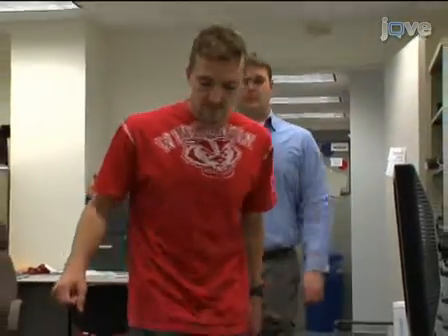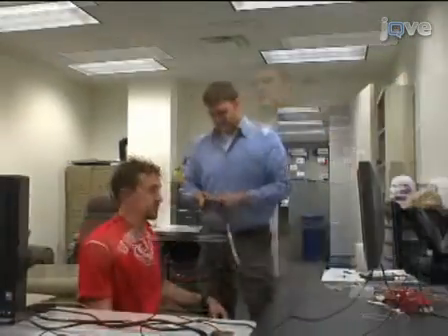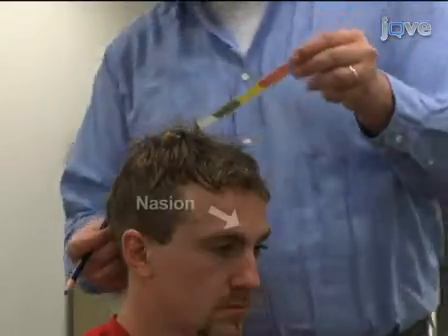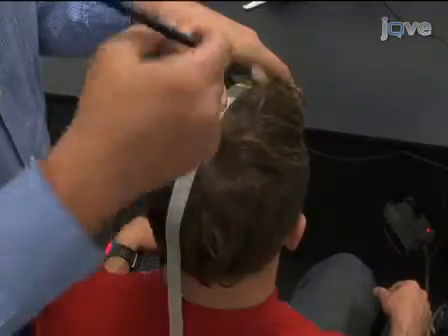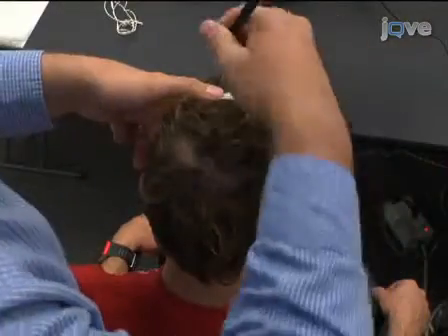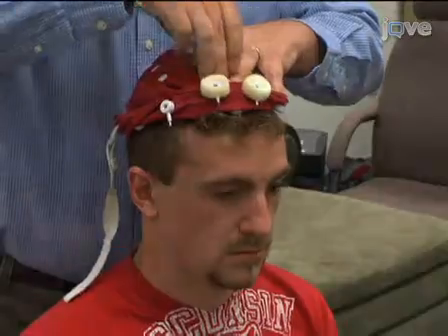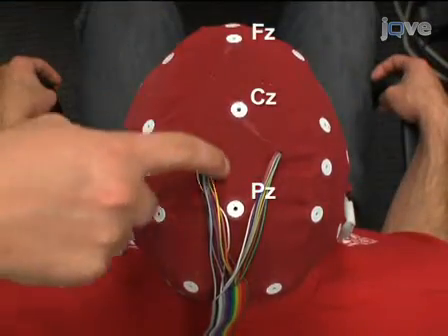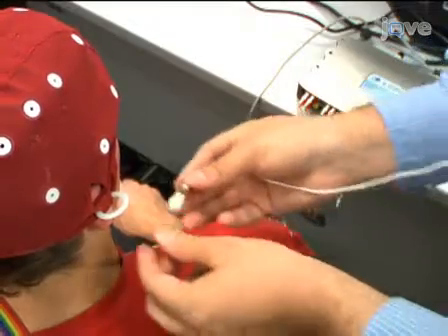You begin this protocol by connecting EEG electrodes to the subject's scalp through an EEG cap, which positions the electrodes according to the 10-20 International System. To correctly position the cap on the subject's scalp, use a felt-tip pen to mark the nasion, which is the intersection of the frontal nasal bones, and the inion, the largest protrusion of the occipital bone. Find the halfway point between nasion and inion and mark it — this position is called the vertex. Find the CZ electrode on the cap and position it on the vertex. Keeping CZ fixed, slip the cap onto the head. Ensure that the FCZ, CZ and PZ electrodes are on the midline of the scalp, that the O1 to O2 electrodes are horizontal and level with OZ, and that FP1 to FP2 are level with FPZ. Now, attach the reference electrode, which typically clips onto an earlobe.